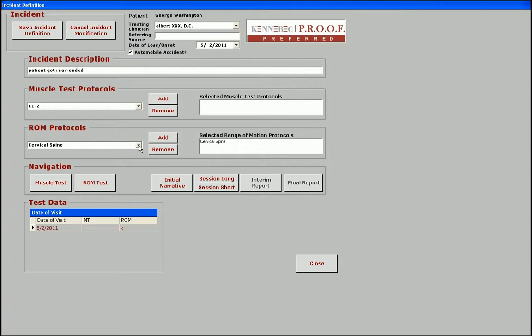Let's go ahead and check out the range of motion protocols. There are three predefined protocols that come with the system: thoracic, lumbar, and cervical. In another area of the software, you can also create your own protocols. The protocols give you a quick way of assigning a number of tests without having to assign each test individually.